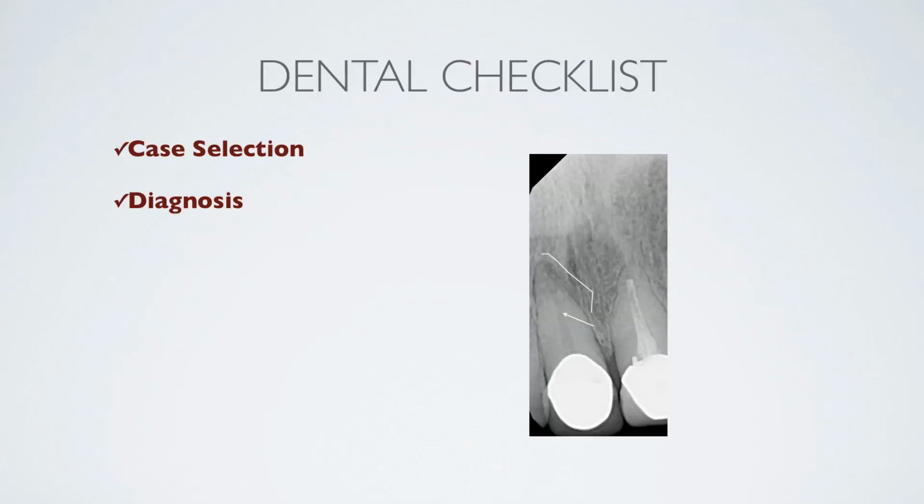Also, when examining the radiographic lesion, we notice it is not centered over the apex of the root, which leads me to believe that there is more than one portal of exit for the canal. Since I always keep the end in mind, this makes me fast forward to the irrigation obturation phase of treatment, knowing that I will need 3-dimensional disinfection and thermoplastic obturation to complete the case.